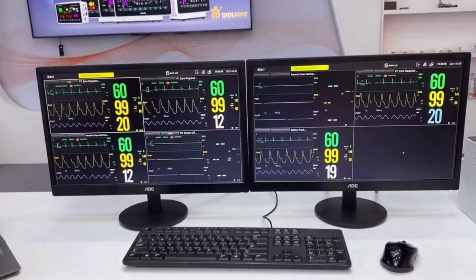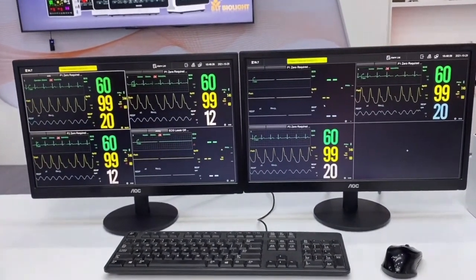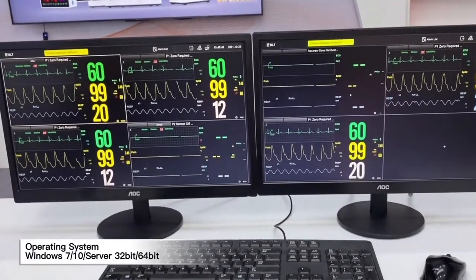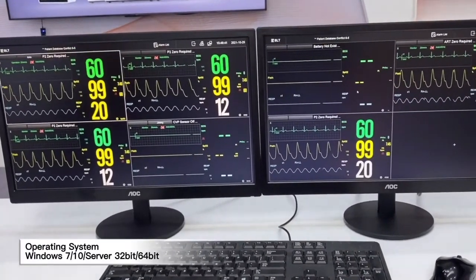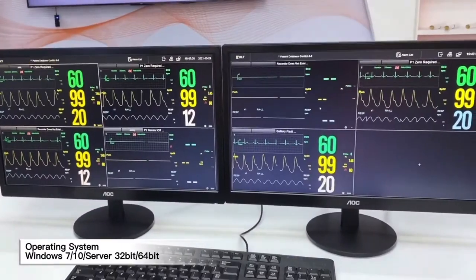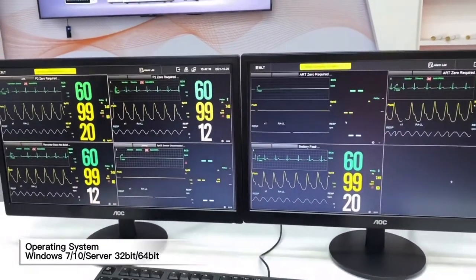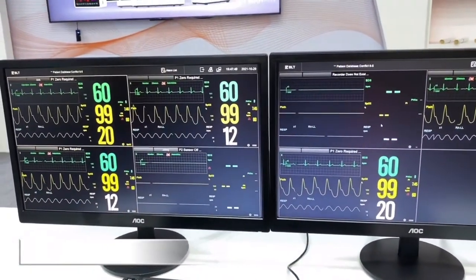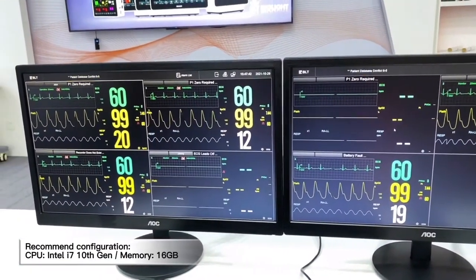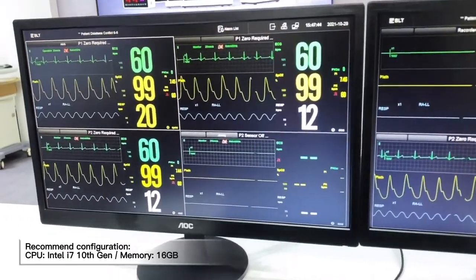As you can see, we have already connected seven patients in the system. The operating system is Windows 7 or Windows 10 with a server of 32-bit or 64-bit. The recommended configuration is CPU Intel i7, 16GB.